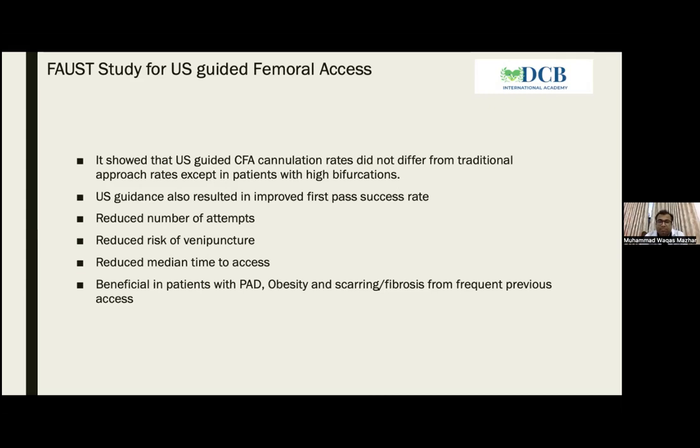A third important piece of information is if there is a calcification, because you should avoid puncturing where you have calcification, since you will probably have some hemorrhagic complication. With these three pieces of information, which are, I repeat, very fast in a normal case, it's easy to implement the ultrasound in your cath lab.